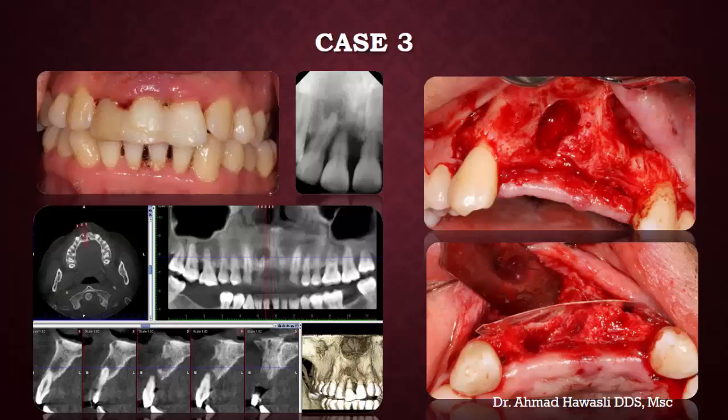This is another case. The patient came with severe chronic periodontitis and severe bone loss, and also with significant bone loss periapically.